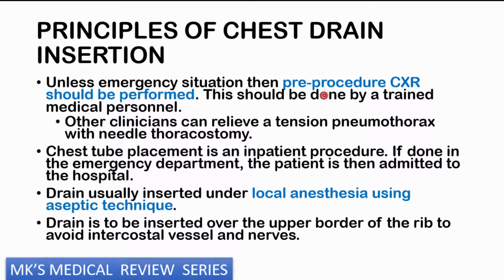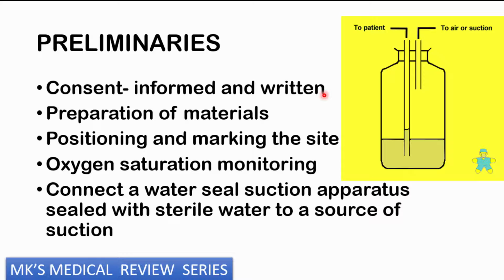You can't do an ICD and send the patient home, because they may not know the do's and don'ts of the ICD at home. And of course, there may be other complications that may ensue. The drain is actually inserted under local anesthesia with aseptic technique, and it is supposed to be inserted over the upper border of the rib, to avoid any damage to the intercostal vessels and intercostal nerves.